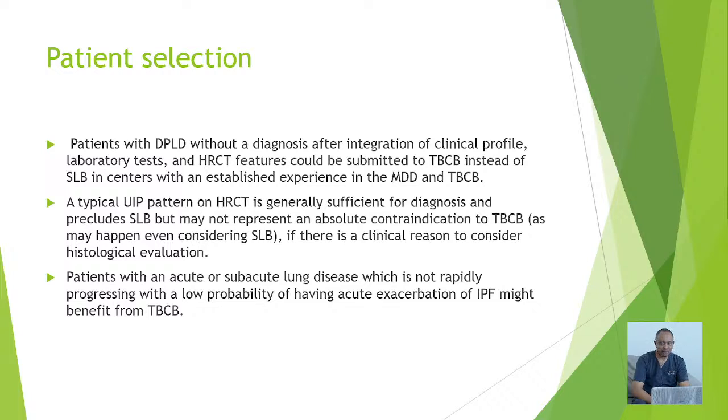Before sending a patient for cryobiopsy, it is important to have a clinical pathologic discussion and also discuss with the radiologist, because there are some diagnoses which we make using clinical and radiologic information, and therefore we may not need to send that patient for cryobiopsy. For instance, the usual interstitial pneumonia. In most cases, a sure diagnosis can be made just using a multidisciplinary approach.